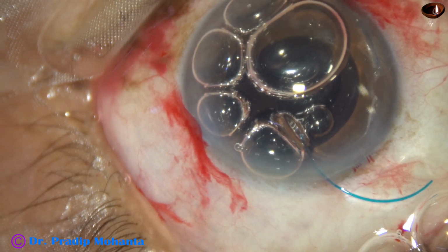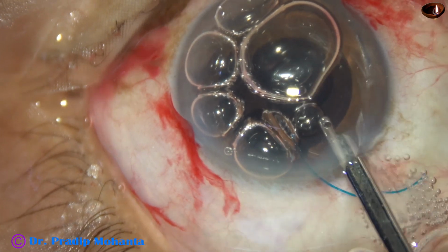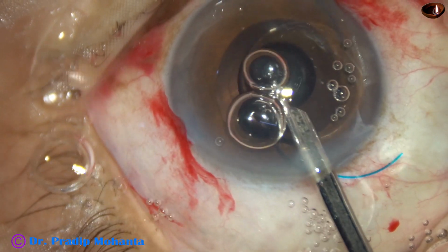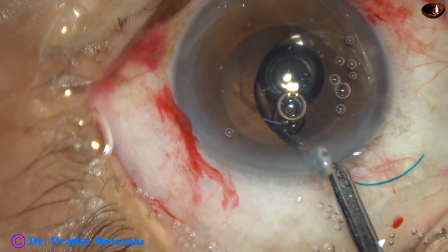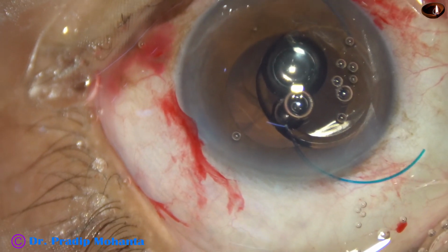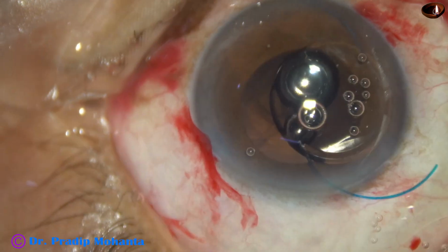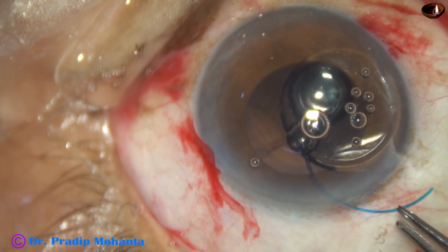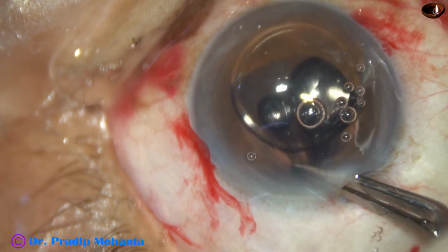And now remove the air. Probably some vitreous strands are already prolapsing into the anterior chamber. And now the trailing haptic is first placed in the sulcus.